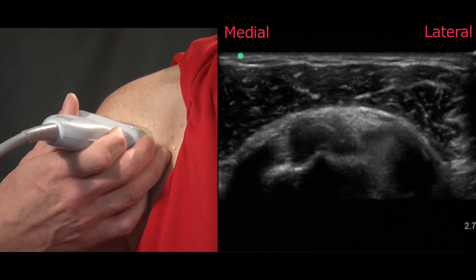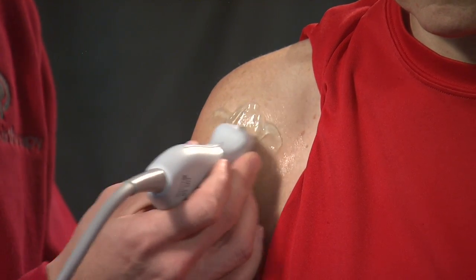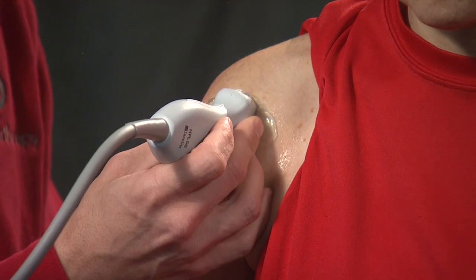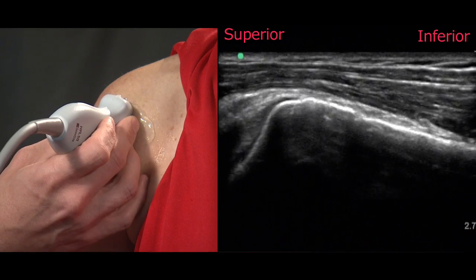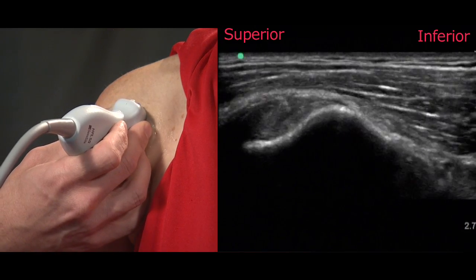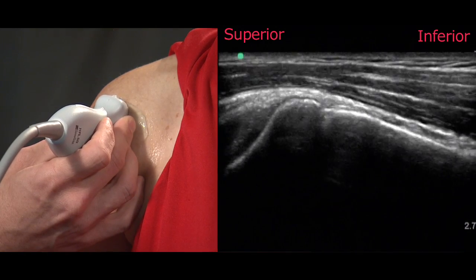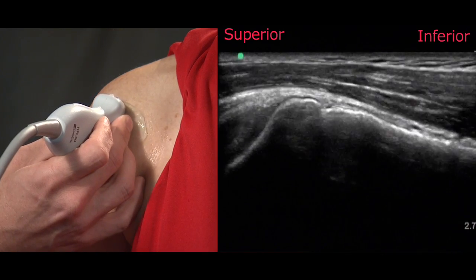Once we've completed our short axis examination we'll flip the probe to assess the long axis of the biceps tendon so that we understand a three-dimensional image of what the biceps looks like. By sliding medially and laterally we can appreciate the integrity of the tendon.